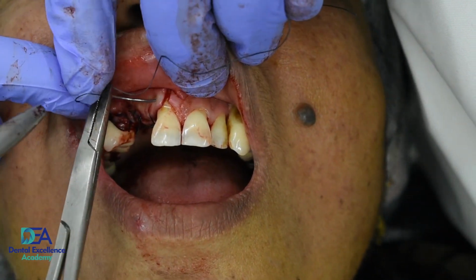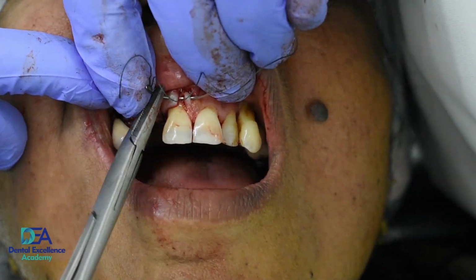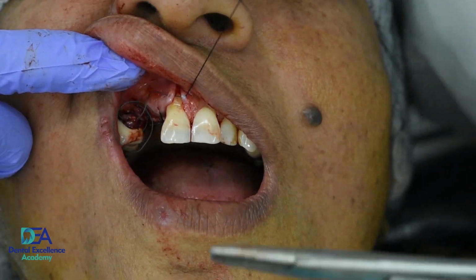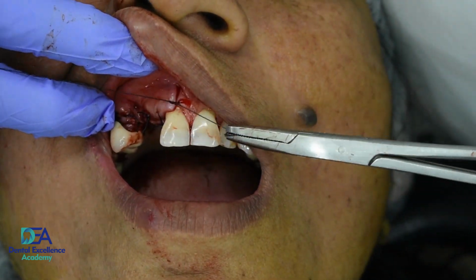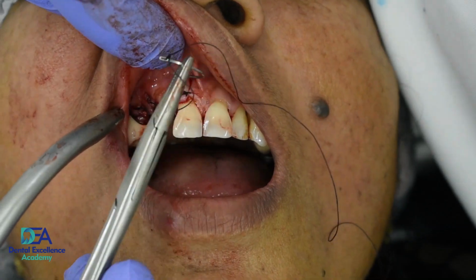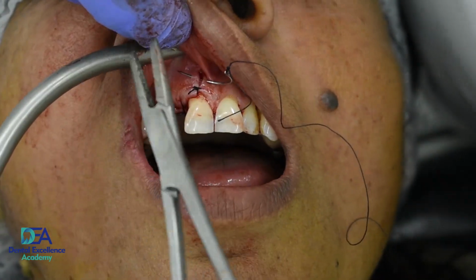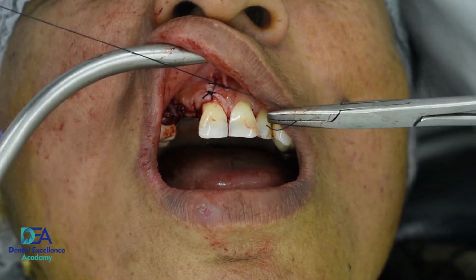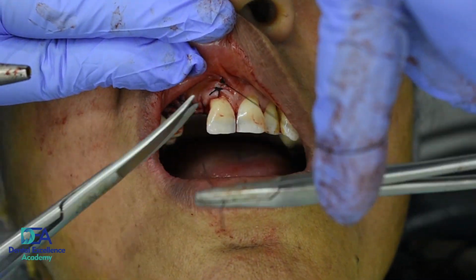In the region of the central incisor, I am placing one suture. There was a bit of recession in that region initially. So I am giving a good tight suture in that region so that we can cover the roots of 1 1.